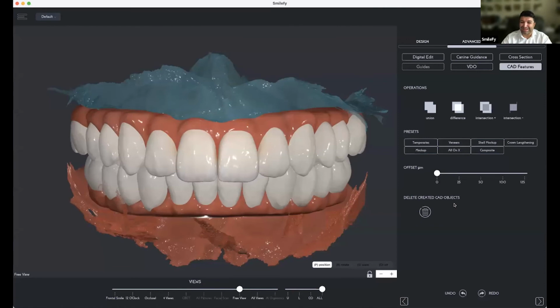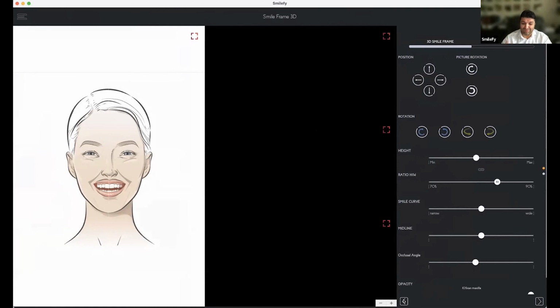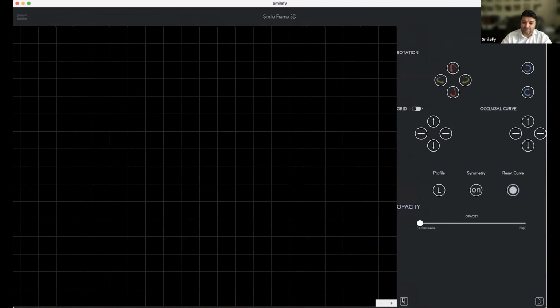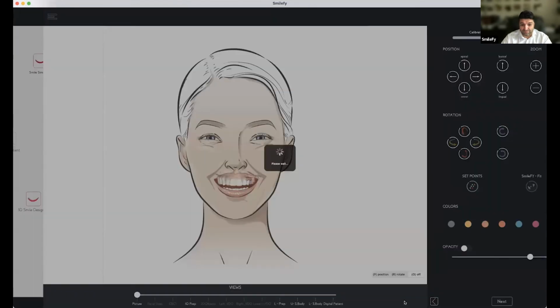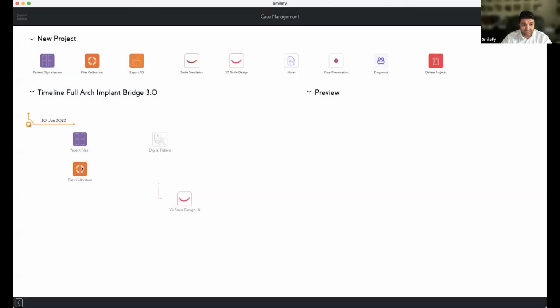Thanks, man. Hermano, gracias. Adrian has very complex cases and sometimes also very emotional cases, with people who are sick and going to die, and then we do something to make the rest of their life in a way with dignity. So okay, let me show you the process with the scan bodies. The way it works is like this.